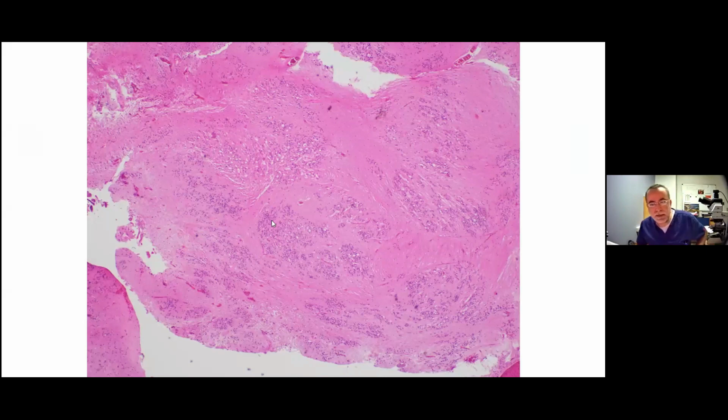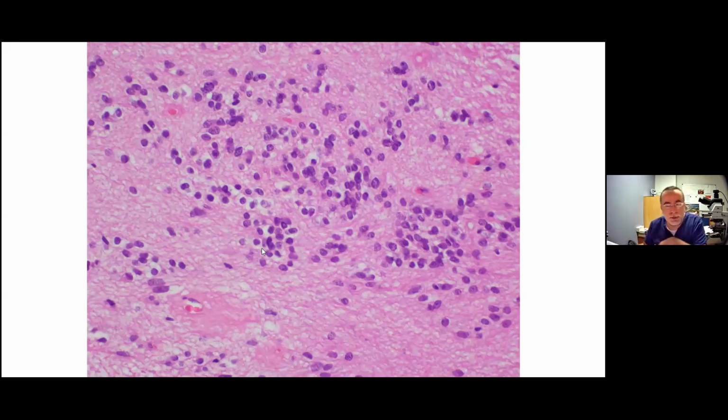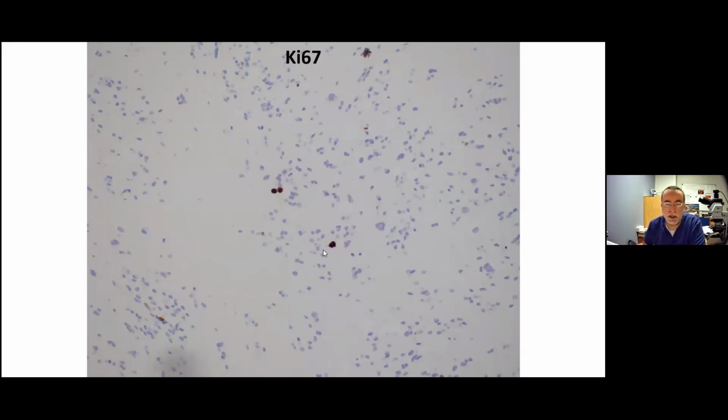Okay, so this is the lesion at low magnification. It is a subependymoma, and one of the most important characteristic histologic features of subependymoma is that at low magnification, as opposed to ependymoma, which usually has a diffuse growth pattern, this one has nodular growth. So this is pretty characteristic. On closer look, you can see that the tumor cells do not have any atypia or pleomorphism, and these are the nodules, and the area between the nodules is hypocellular and vaguely fibrillary. This is another feature of ependymal differentiation, whether it's subependymoma or ependymoma. On closer look at the tumor cells, no mitosis, no necrosis, no vascular proliferation, which are high-grade features. The atypia and pleomorphism are very minimal, meaning there is minimal variability in size and shape of the nuclei. And Ki67 is also characteristic, about 1 to 1.5%. So this is an example of subependymoma.